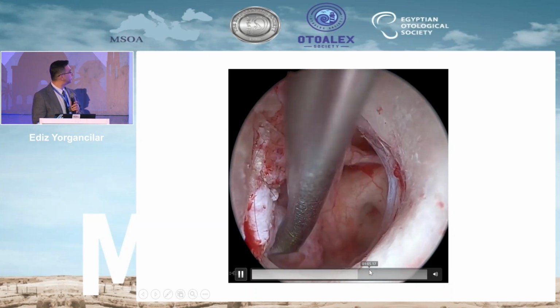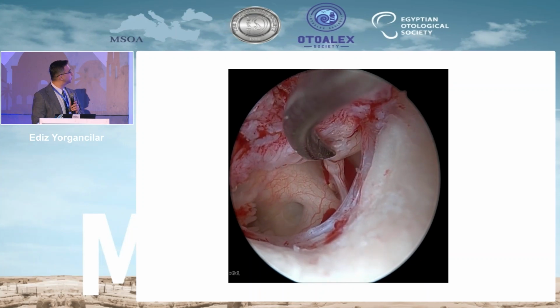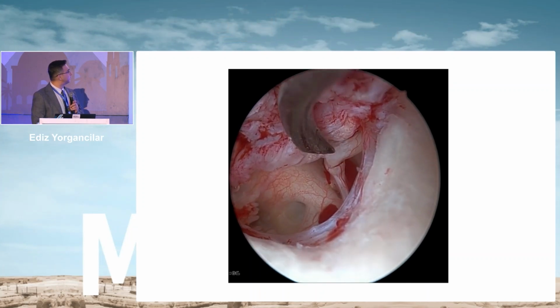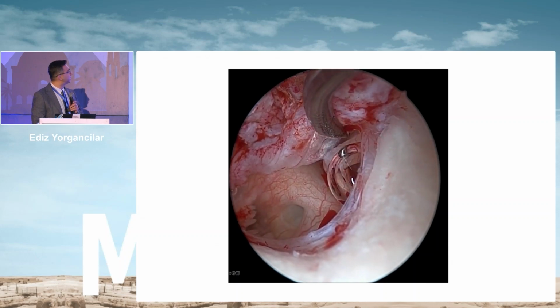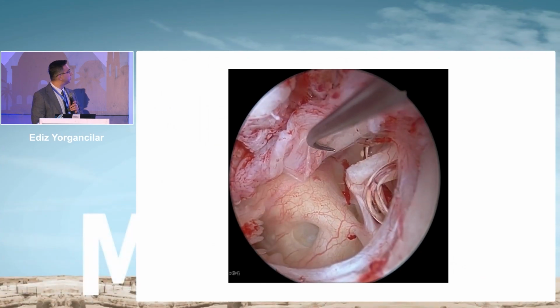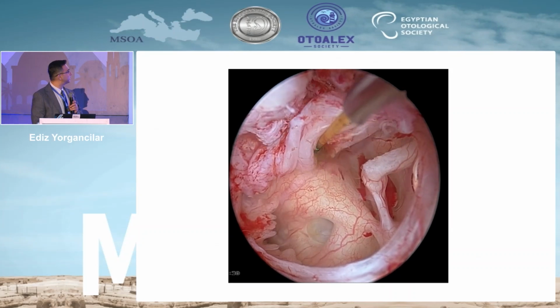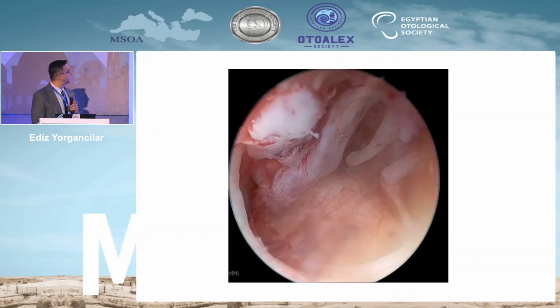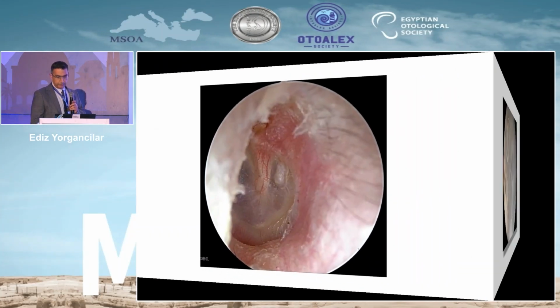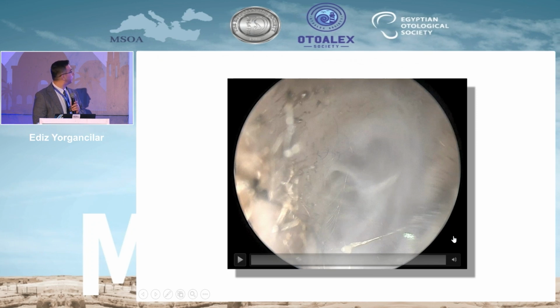And then entrance to the middle ear cavity. As you can see, air bubble and the antrum, and you can easily dissect from the adhesion line very gently during the surgery, and manually dissect with laser and the dissectors, and the grafting. Yes. Another patient.